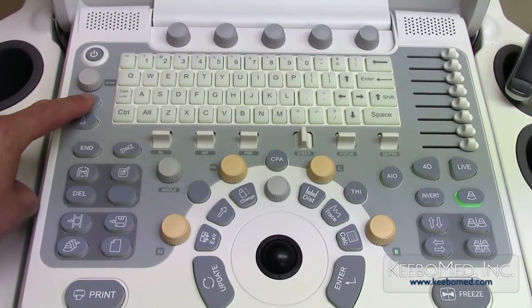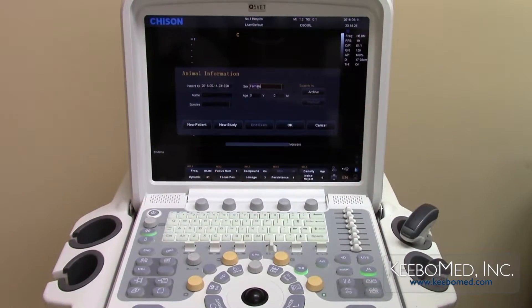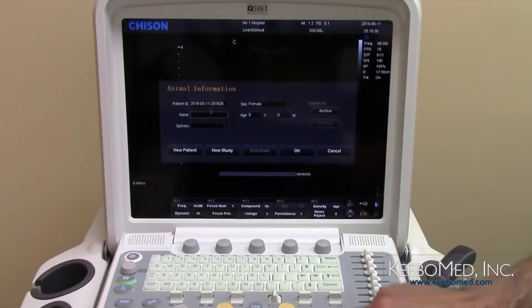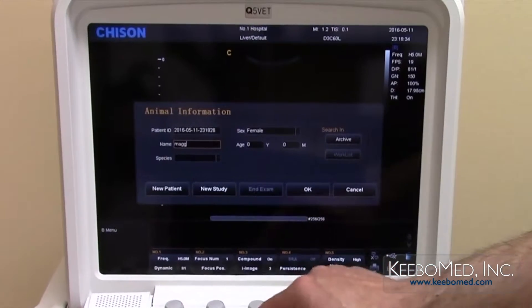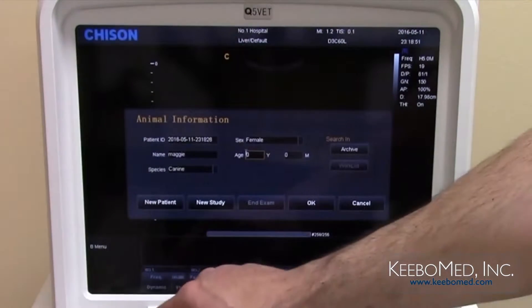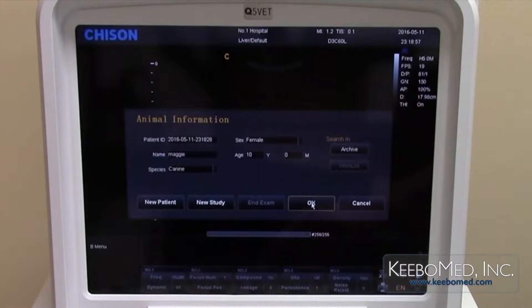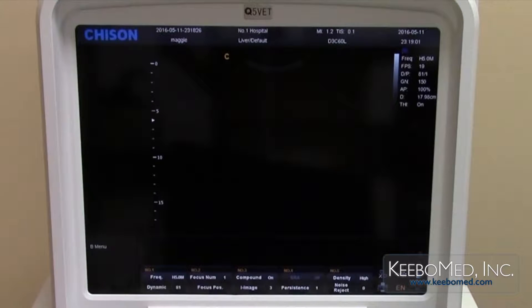First, press the patient key to enter the animal information. A patient ID number is automatically generated. After the information is entered, select OK on the bottom right of the screen. The patient information will now be displayed on the top left of the screen.